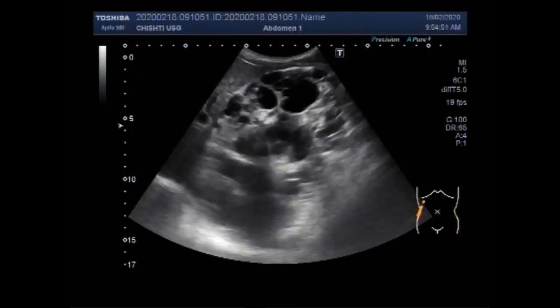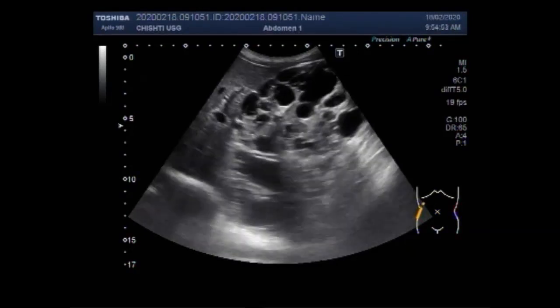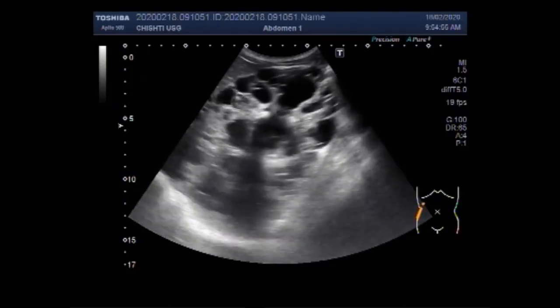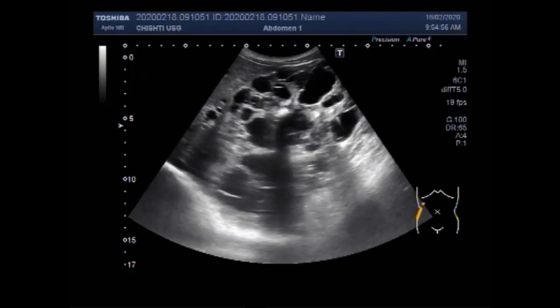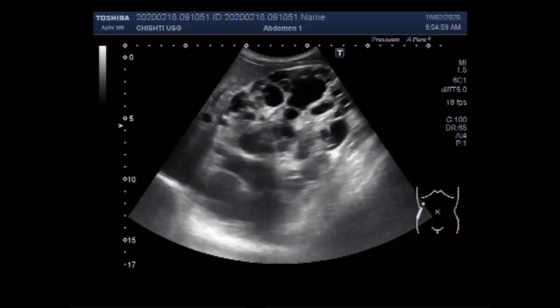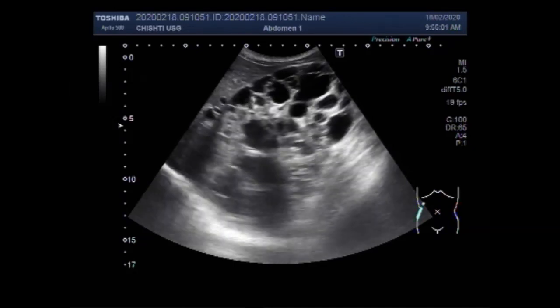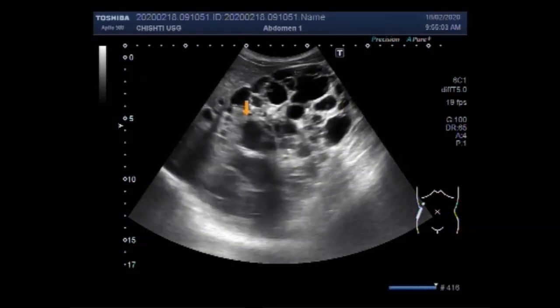Dear viewers, I hope you are all fine. This ultrasound video shows polycystic kidney disease. Autosomal dominant polycystic kidney disease, ADPKD, is a disease where cysts are seen in both the liver and kidneys.